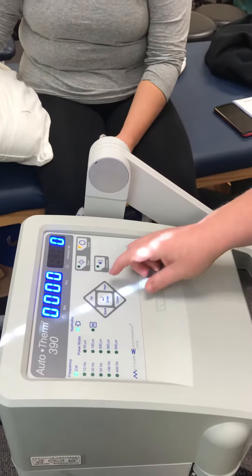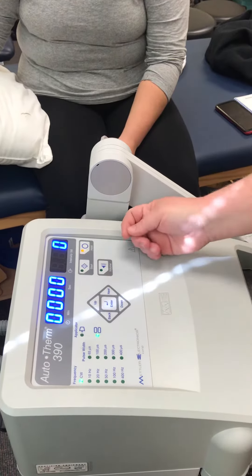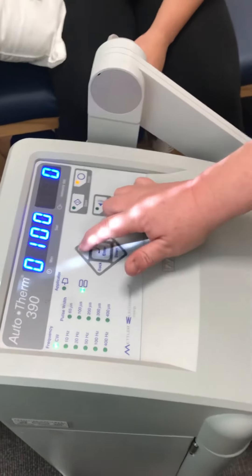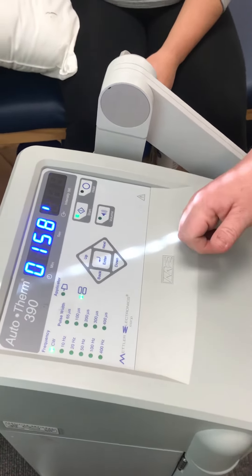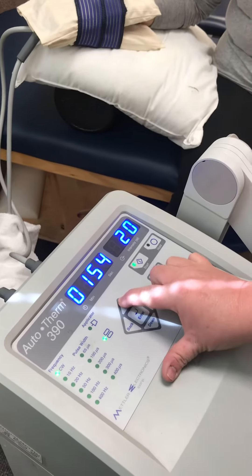Set this for the pads. CW. Then it's supposed to be 20 to 30 minutes, but we're just going to set it for two minutes. And we're going to go up to 30 watts.